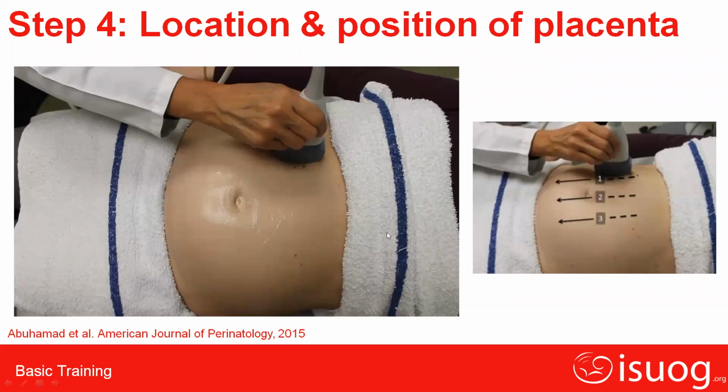And placental thickness and placental grading will be taught, I think, later on. It is taught in that purview, so I'm not going to talk about the grading and the placental thickness. The next slide will be on the estimation of the amniotic fluid.